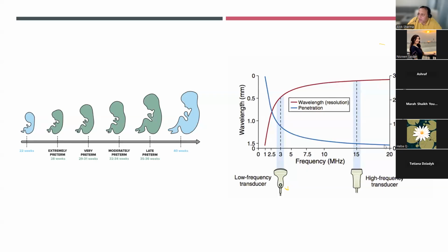Naturally, as the frequency goes up, what you find from your perspective is that the actual wavelength between tissues is less, and with a high frequency, penetration is compromised, as this graph shows.